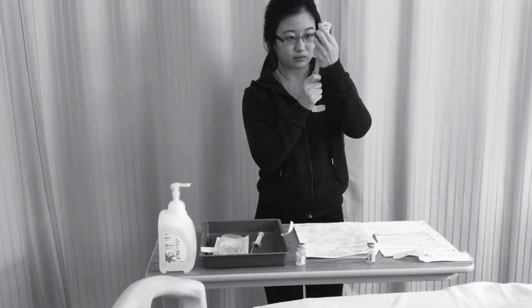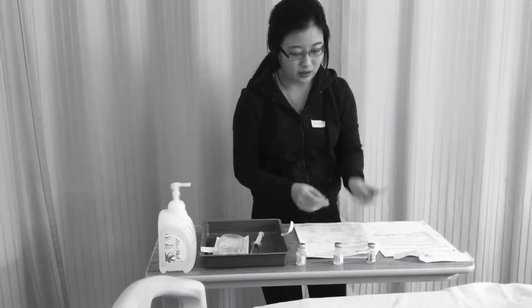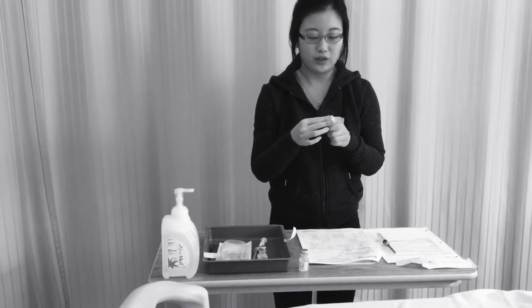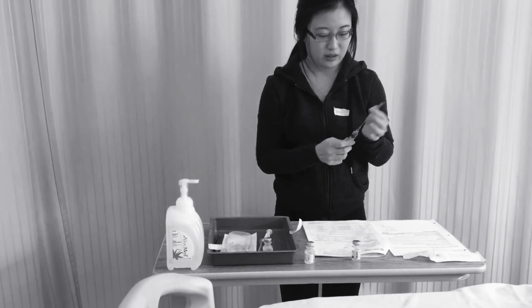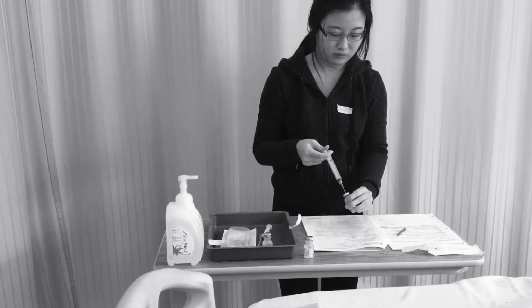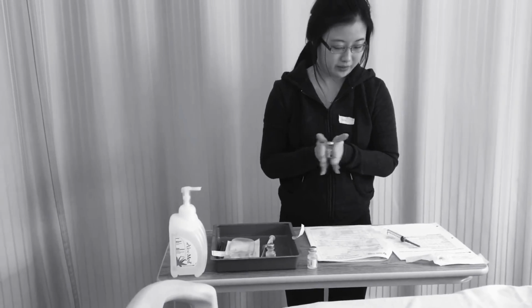I'll be rolling this vial to ensure that the medication is mixed properly. So that is 1.8. And now I'm going to put that into my vial to reconstitute it. Once again, I'm going to alcohol swab it for 30 seconds and let that dry. And now that it's dry, I'm going to put this in. I'm going to mix that just by rolling it.